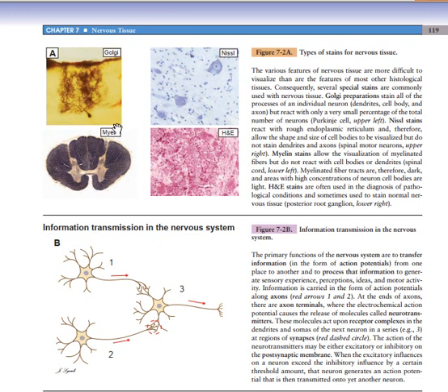The next one is the myelin stain. The myelin stain is used to stain the myelin sheath. It stains the myelin sheath dark, as you can see. That's why the white matter, as you can see here, is stained dark, because the myelin sheath stains darker. Now the next one is the hematoxylin and eosin stain. The hematoxylin and eosin stain can stain all the neuronal cells, but you see the distinction is not quite clear. You can visualize the cell body, and it also stains normal neuronal cells, but it is mostly used in pathologic conditions when you want to visualize necrosis and all that.